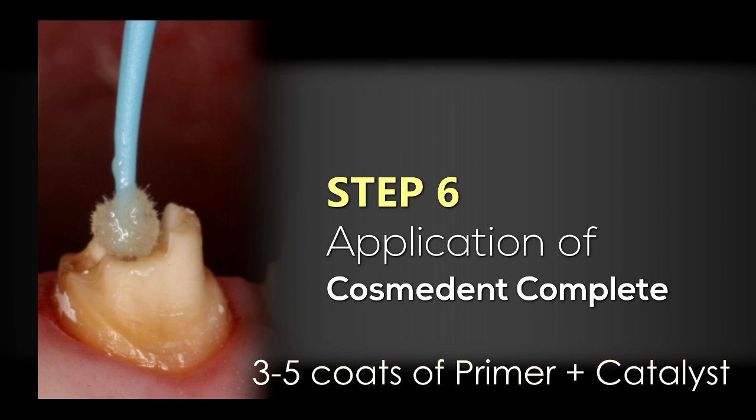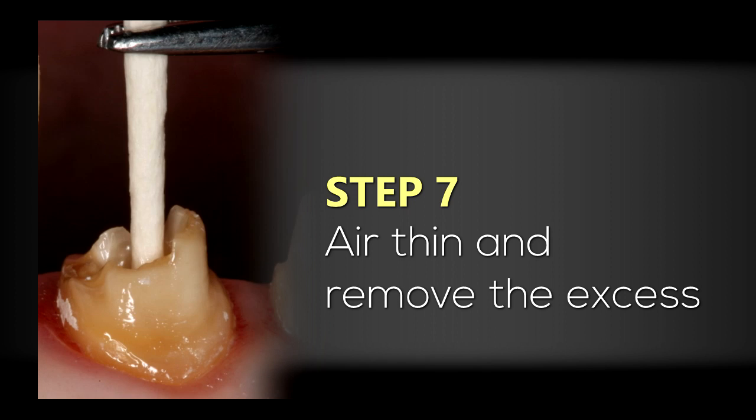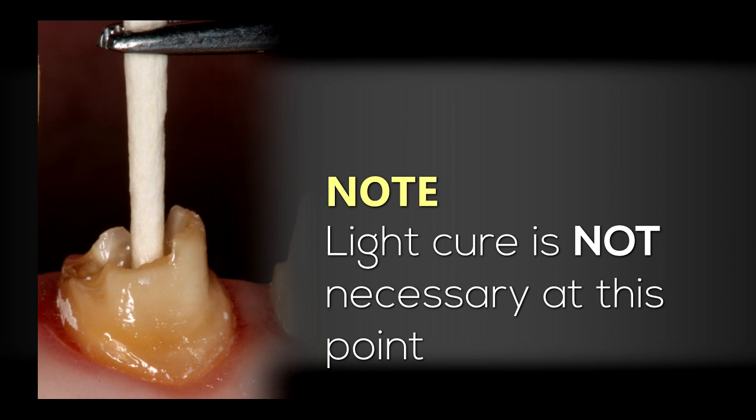We want to make sure that we get the adhesive down into the canal space. I may use dry points again to ensure the adhesive reaches all the way down into the post system. Then we're going to air thin and use high volume suction to remove the excess, and dry points to remove any excess primer adhesive. We don't light cure this because the catalyst makes the system self-curing, so we don't have to worry about light penetrating all the way down into that canal system.